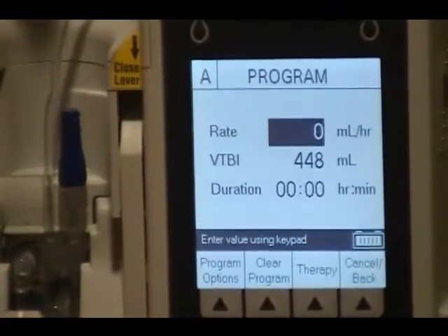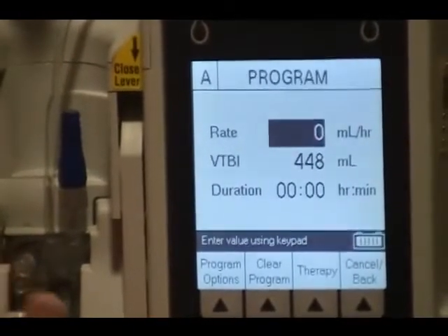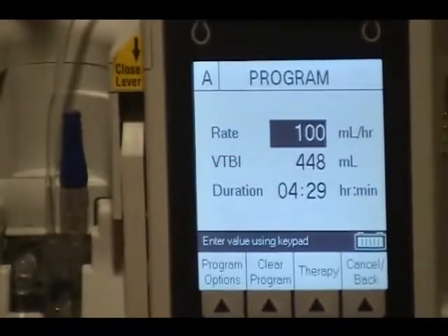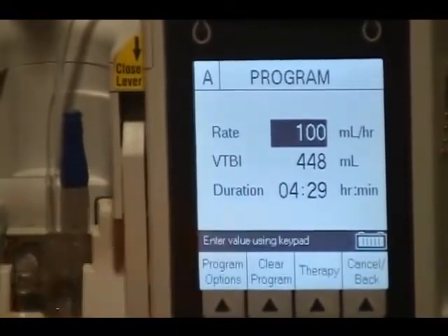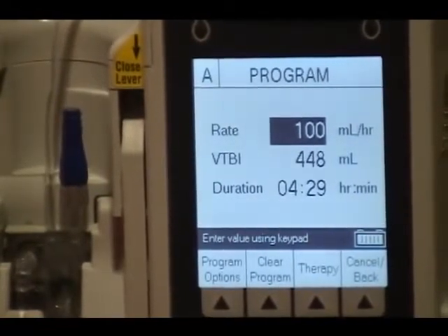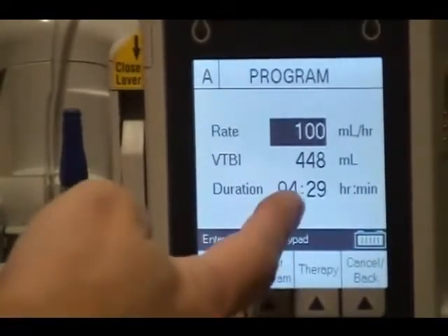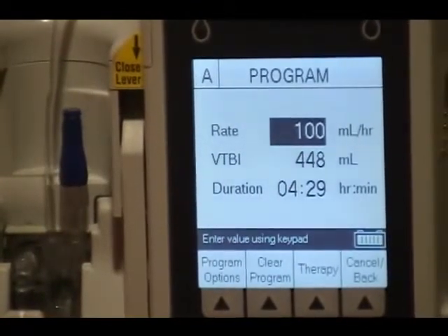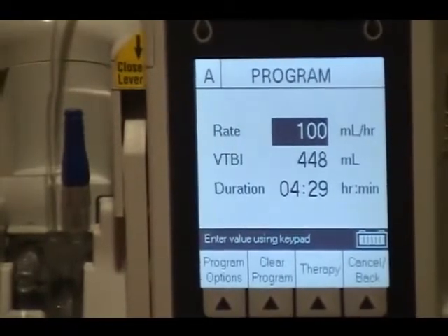So here we go — we're going to clear it again. The doctor says 100 an hour for 448, and it tells me the duration will be 4 hours and 29 minutes. So it will calculate that. Not to say we shouldn't go back and check these calculations, but if you're in a pinch and the doctor says run it over 2 hours, you put 2 hours in and it gives you a rate. You can start it and then verify that the pump is accurate, because it's just a machine like everything else. So I'm going to start this.